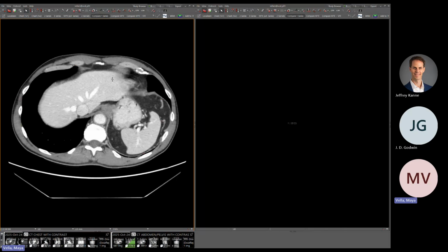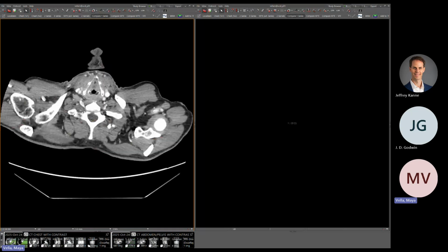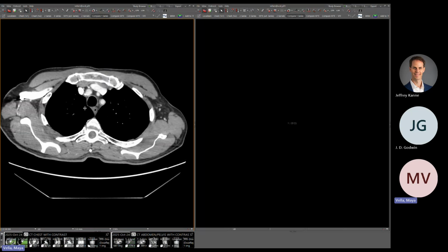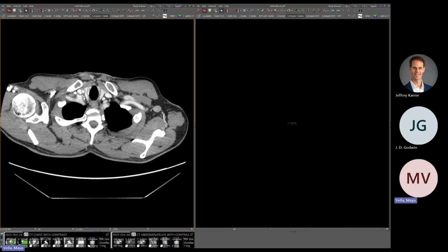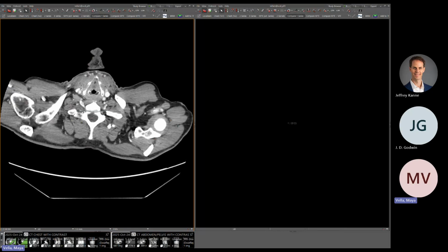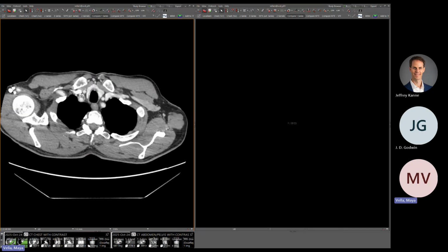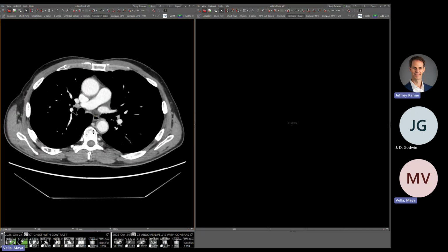Nice. Yeah. And I think this is just, I don't know what your all's experience is. I feel like we do sometimes CTs and sometimes MRIs to look for vasculitis. And I honestly feel like I can find it or I see it better on CT than I often do on MRIs. I feel like the MRIs can sometimes be harder to interpret the wall enhancement. Agreed.